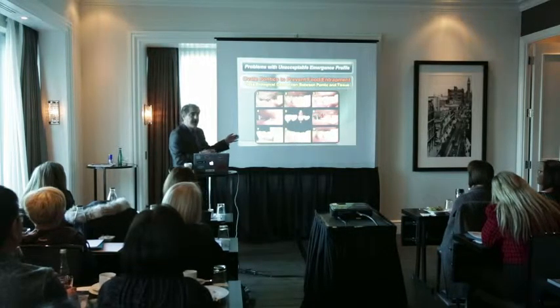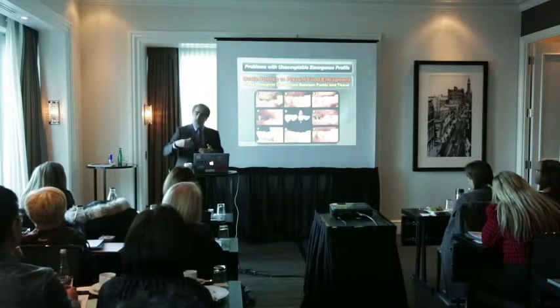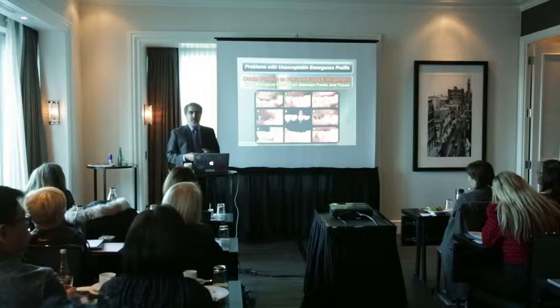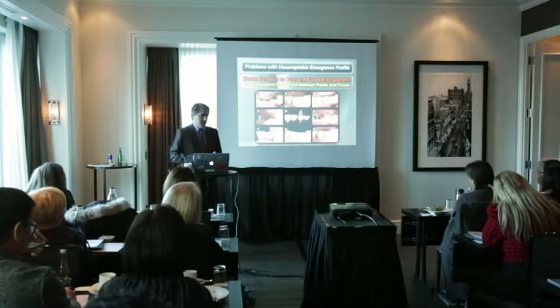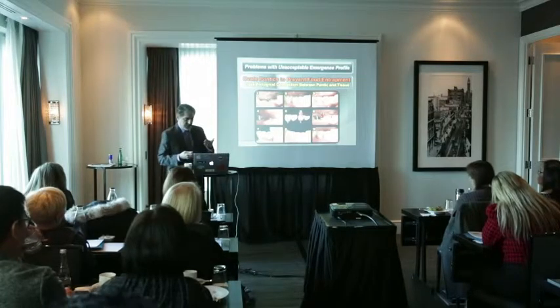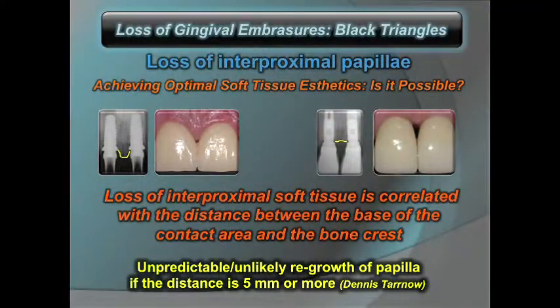And in these cases where you have a pontic or cantilever type of crown, it's better to develop this sort of connection between the gingiva and the pontic. Okay, let's move on. What would be your hygiene instruction for the patient in this case? Do not clean under the pontic, because once you start cleaning there won't be any biological connection between the two.